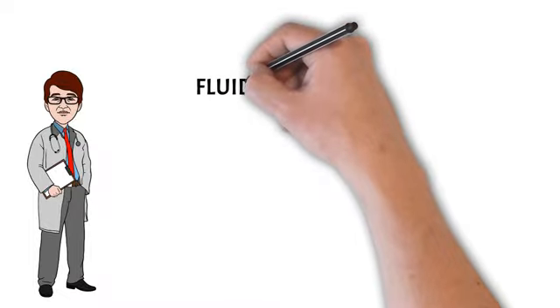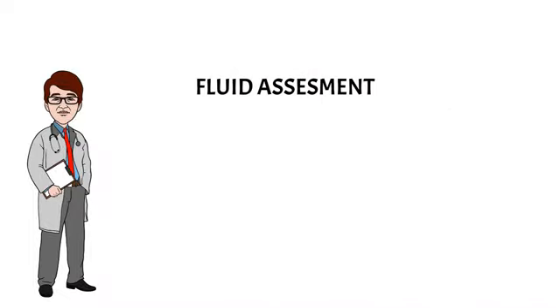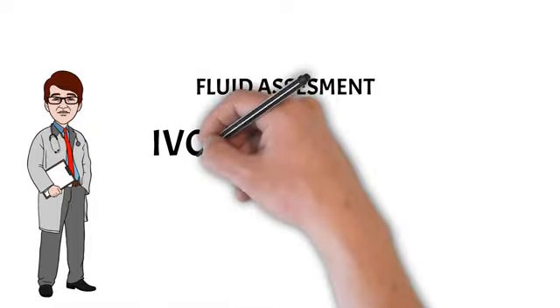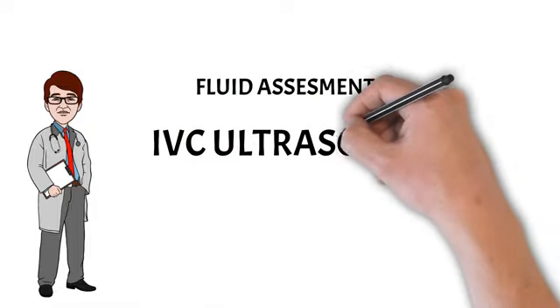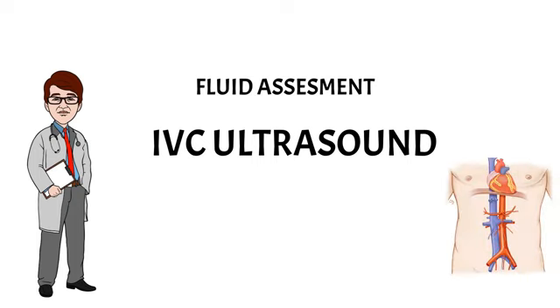So friends, today the topic of discussion of the class is to study the ultrasound on IVC, which is mainly done to assess the fluid status of the patient. So let's go and study the topic in detail.